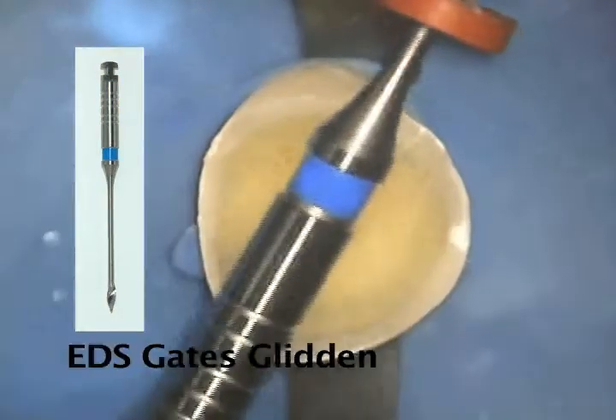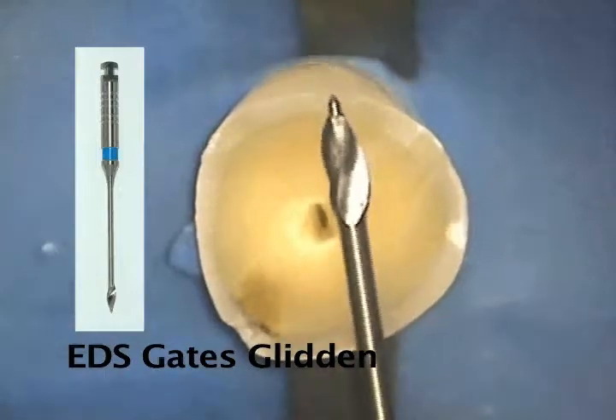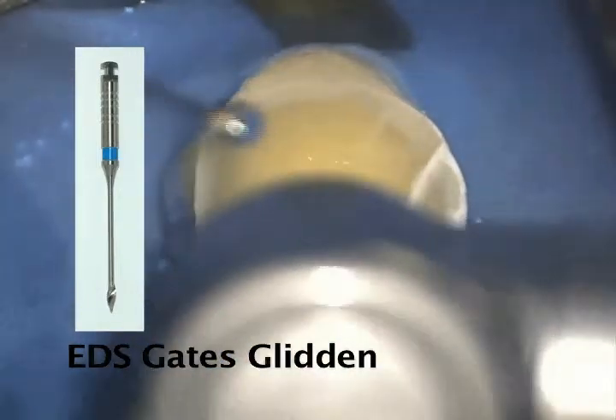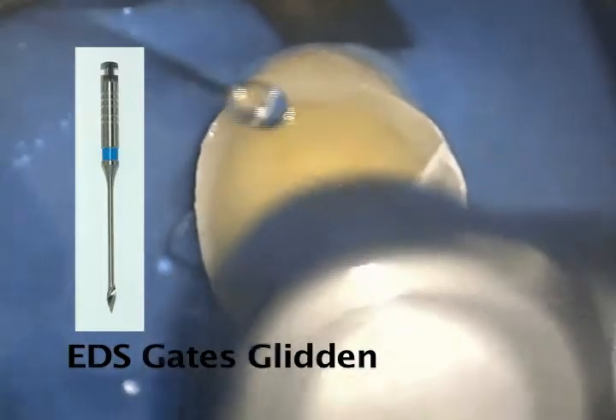In this case, we have selected the blue number two FlexiFlange fiber post to restore this cuspid tooth. We remove the gutta-percha and create 100% of the length of the post hole and 90% of the width of the post hole with an EDS blue color-coded Gates Glidden drill.